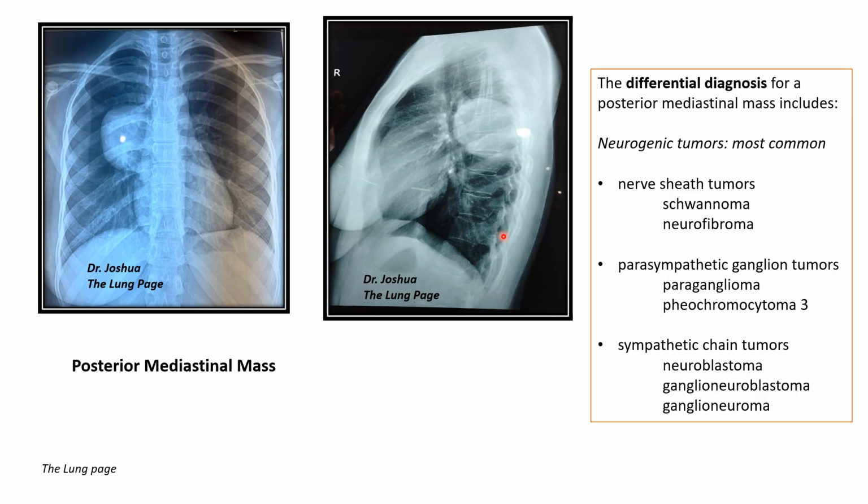I think now you people are very clear about the causes of posterior mediastinal masses and about the hilar overlay sign, right?